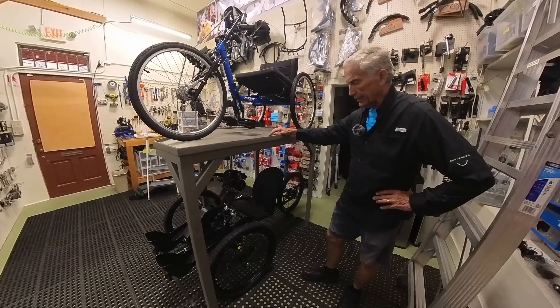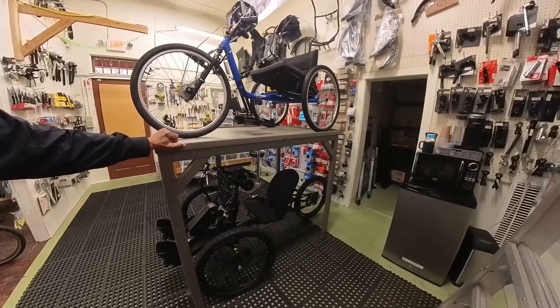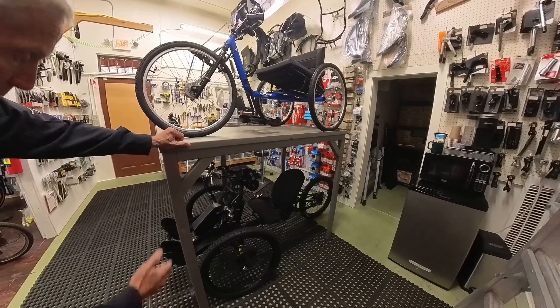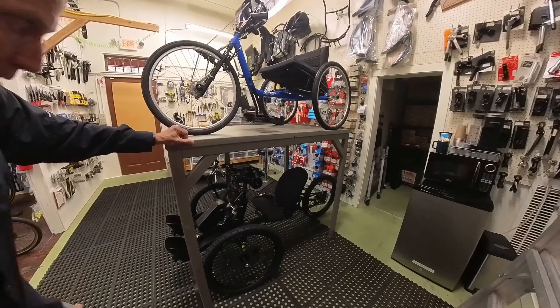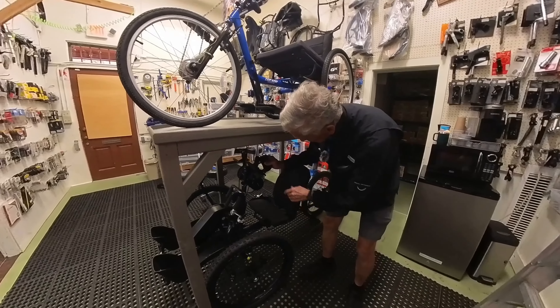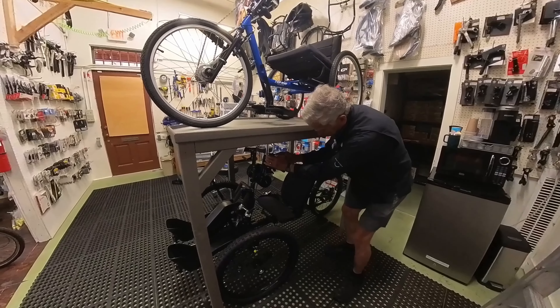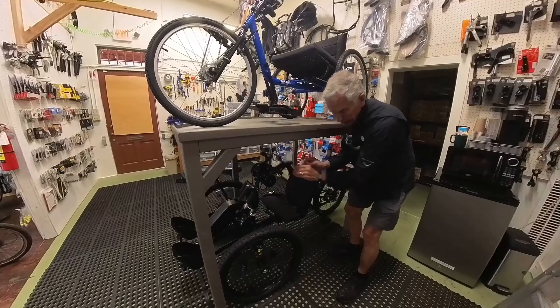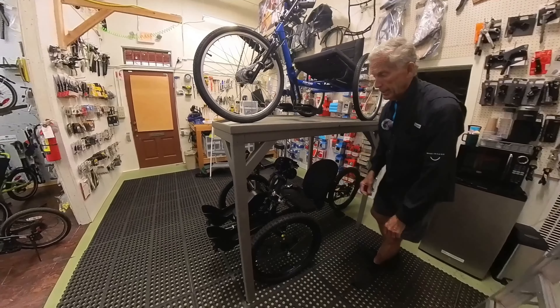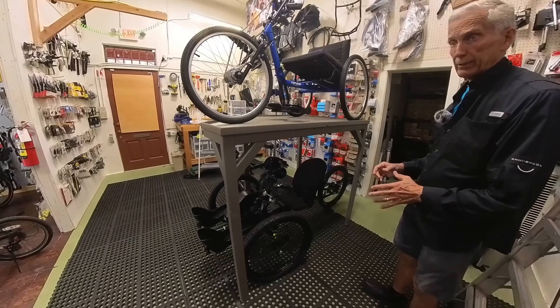This is actually designed as a hardcore mountain trike for quadriplegics. It has e-assist, and it's also got hand pedals. And these are what's known as quad grips. The quadriplegic that can't hold on themselves pushes their arms through here, so even without being strapped onto the pedals, they can pedal. This is the ultimate extreme adaptive trike right here.